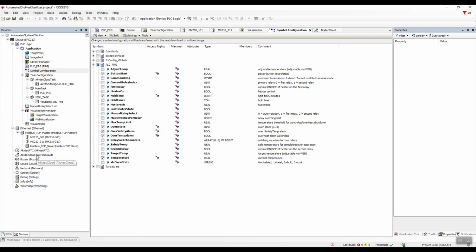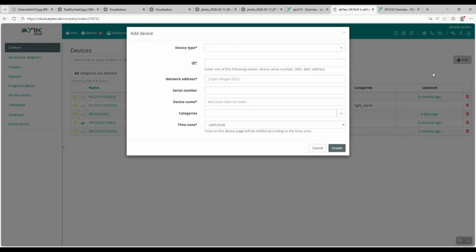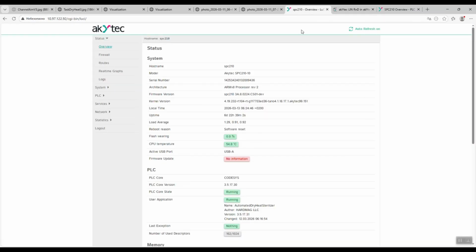Pay attention to the akYtec cloud component. In the project tree, you can set a password for it, which will be used to encrypt the transmitted data. Let's remember it. Now let's go to the web browser, open the akYtec cloud service, and add a new device. Let's select the device type, Programmable Controller, SPC210, and for the addition method, choose Auto Detection. We'll also need to enter its serial number, which you can find in the controller's web configurator.